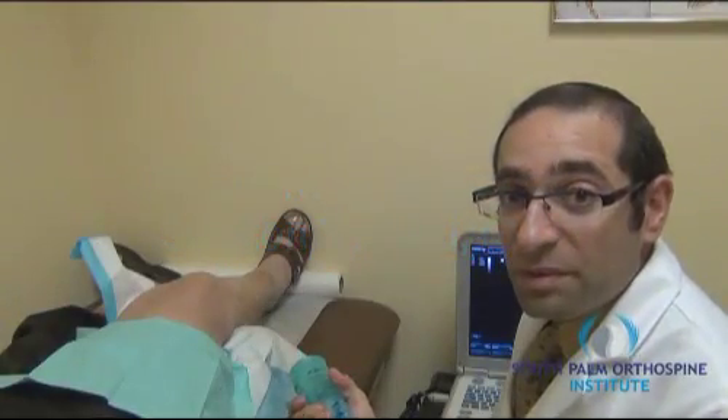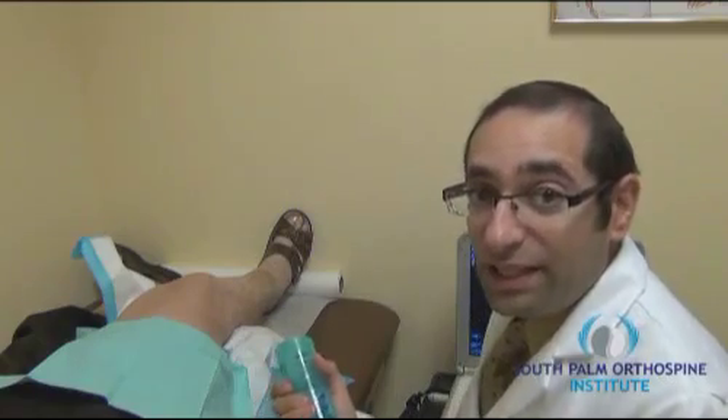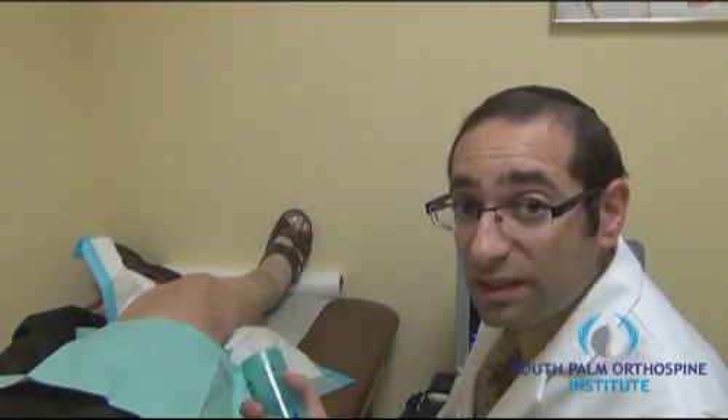Hi, I'm Dr. Shimon Blau. Today I will be demonstrating a right knee ultrasound-guided ortho-visc injection.